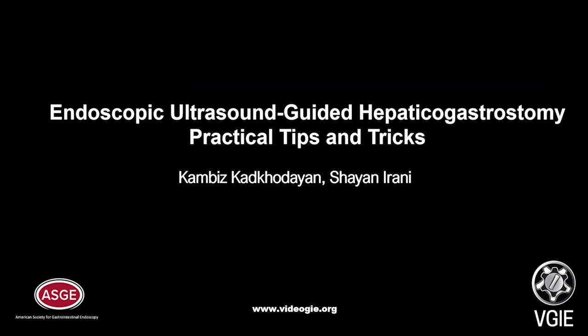Endoscopic ultrasound-guided hepaticogastrostomy, practical tips and tricks.